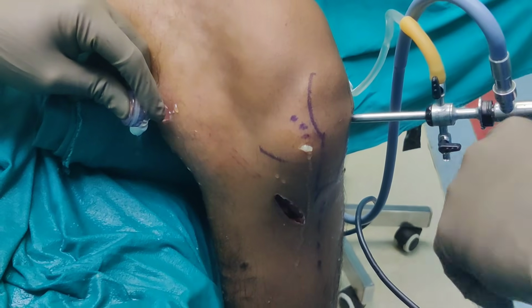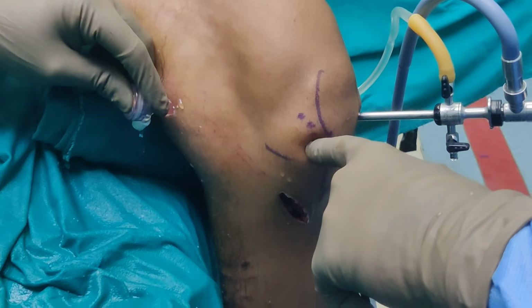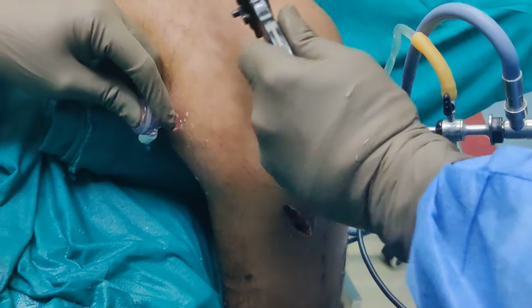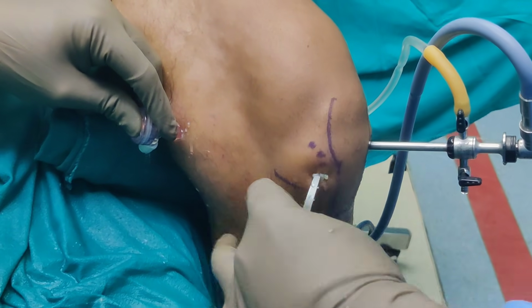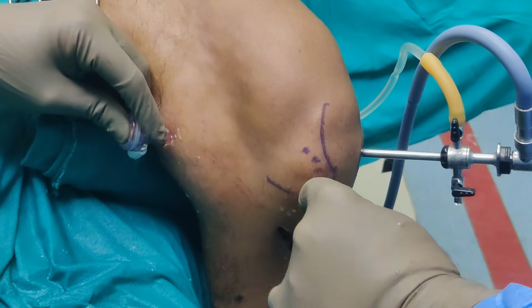So far we have used two portals, mostly the anterolateral portal and the anteromedial portal. These are high portals, and the posterior medial portal. This is going to go inside, so it goes upside down, and then you rotate it, and this is set at an angle of 65 degrees. I'm just going to pass it inside the knee and then I'm going to show you how it looks.